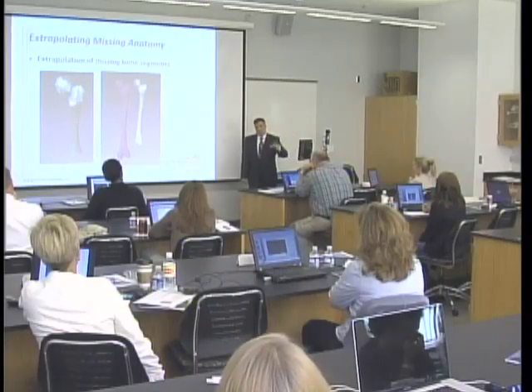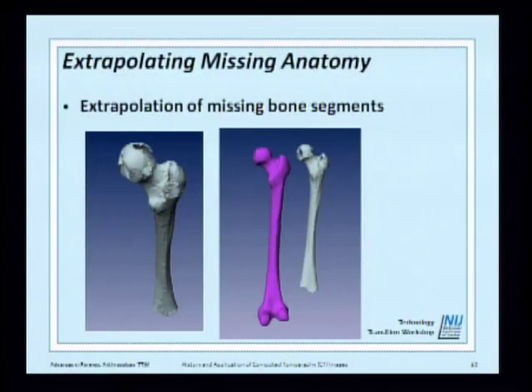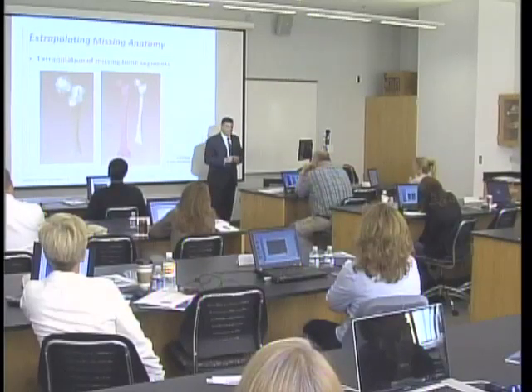The shaft has a low variation, unless you are looking at the isthmus or the IM canal. So we know that every atlas has its own weights. From statistical inference, we can predict that the proximal part carries more information than the distal. So we can have a good, precise prediction. Actually, from this prediction, the height of this woman was 5'2", and when we estimated it, it was correct according to records.